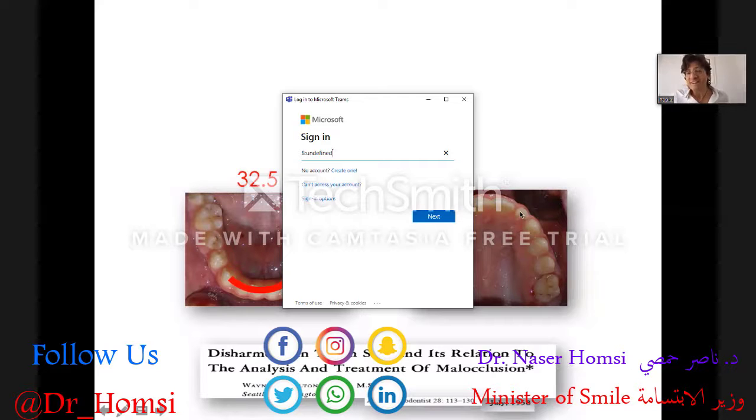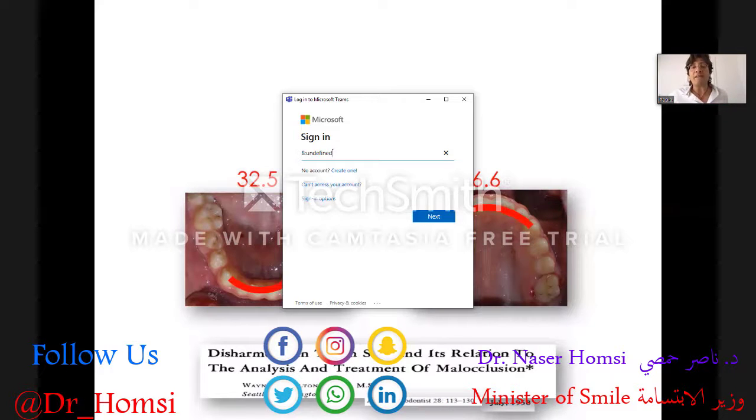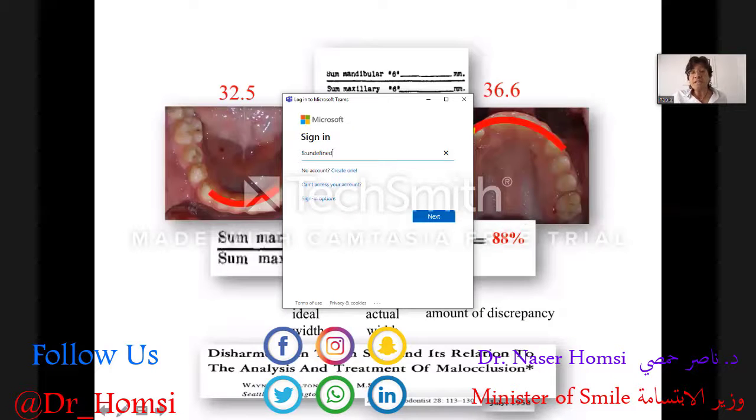because they are peg-shaped, okay? That lateral incisor of Tiziana is peg-shaped. And again, with the Bolton paper, with Bolton indications, we know that if Tiziana measures from canine to canine at the lower arch 32.5, at the upper 36.6, okay? It means we have a Bolton discrepancy, Bolton ratio anteriorly, that is not 77, it is 88%. The ideal width should be 42 from canine to canine at the upper, but the actual width is 36.